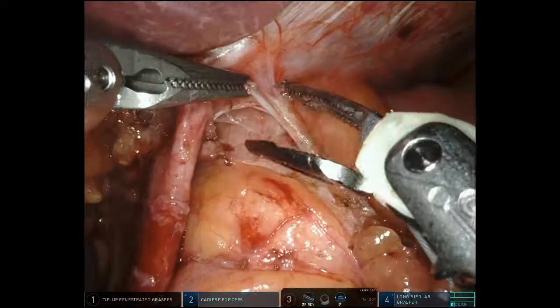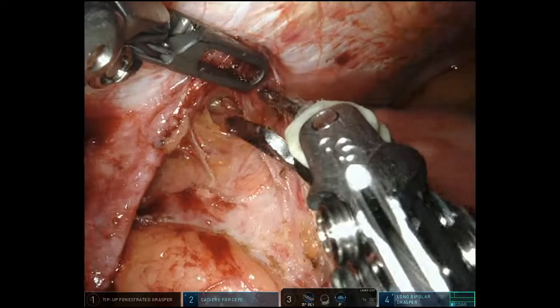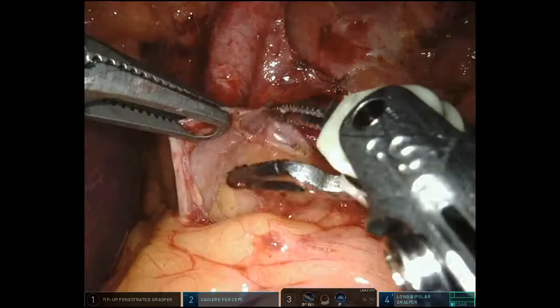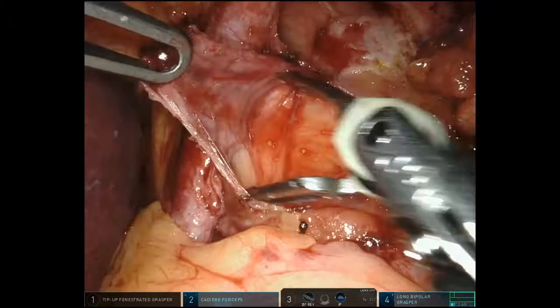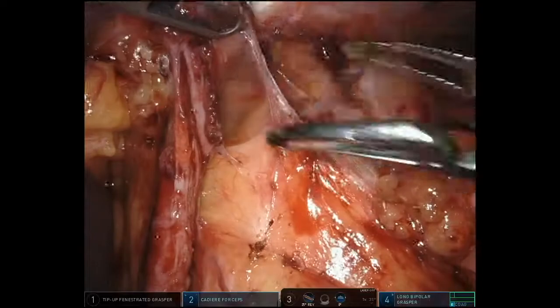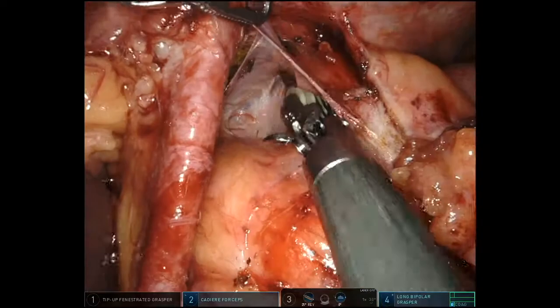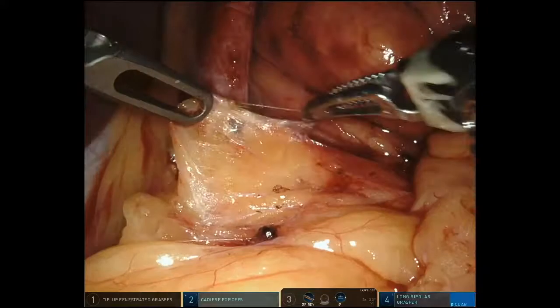This is a good time to talk about the philosophy of reducing the hernia sac and trying to preserve the plane between the hernia sac, the mediastinum, and the crus of the diaphragm. I don't go crazy about preserving that plane if it's hard to do — if it's easy and the plane separates easily, I'll go for it. I think it's more important in really big paraesophageal hernias, like a type 4, because you'll never get the stomach down without dissecting out the hernia sac. This one isn't that big, so I'm not going to knock myself out trying.